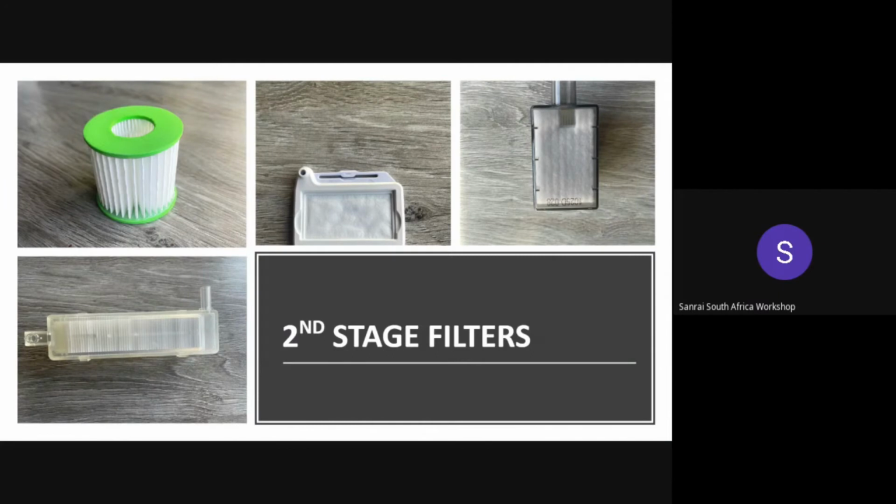For portable machines, these second stage filters cannot be easily accessed. They are only replaced by technicians. They must be checked when the machine has been sent in for a service. The good thing about these POC filters is that they don't have that 6-month service time frame whereby they tell you that you should replace them after a certain time. So the patients don't have to worry about bringing in the machine every 6 months in order to replace the filter or have it checked out.